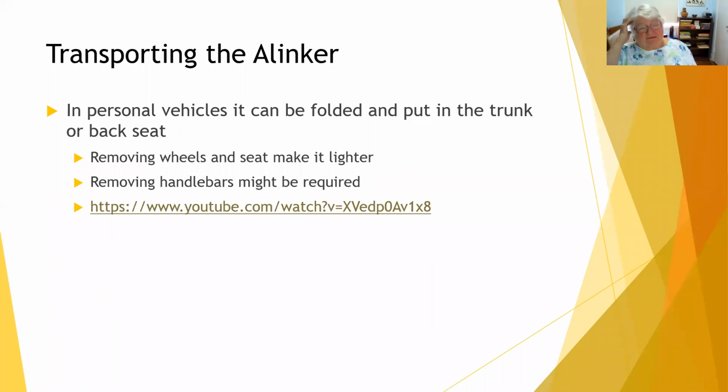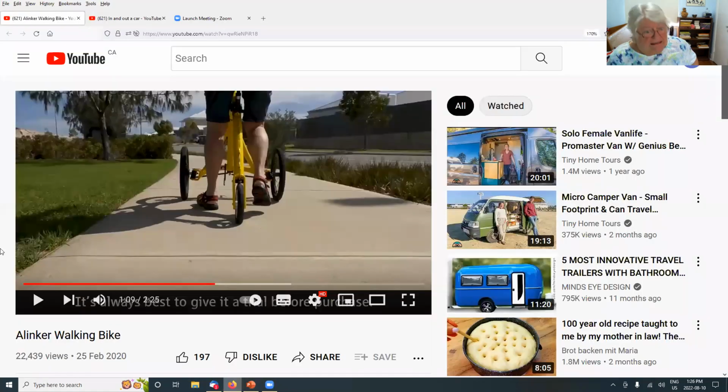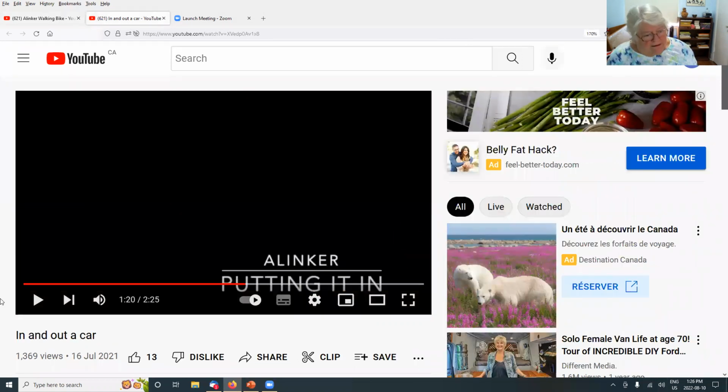To transport it, it can be folded up and put in the trunk or the back seat. If you take the wheels off and the seat off, it makes it lighter. And depending on your vehicle, you might have to take off the handlebars. I have a video of how this is done, and I will show that now.